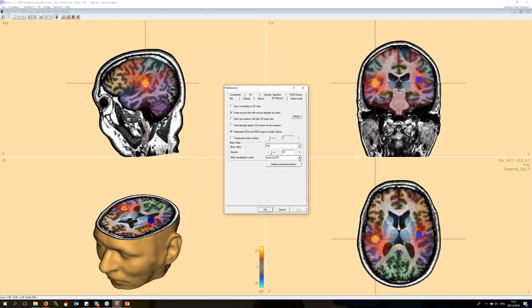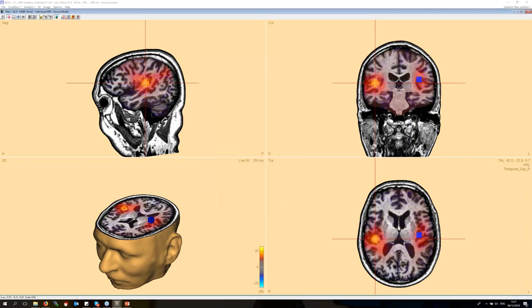And as we already saw before, we can also change the whole visualization mode to either just labels, which will not show anything else in the brain, or we could go to the contour mode where we see the contours of all the different atlas regions, and then we can try and figure out how far this region actually stretches from the area where my source activation is. Okay, so that was a brief excursion to the atlas.